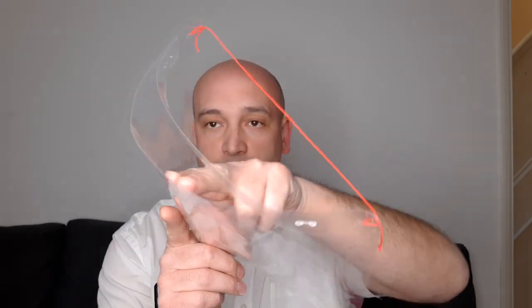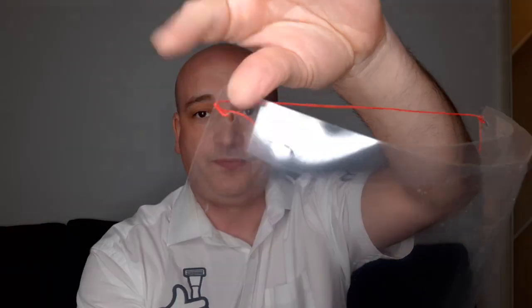This will then keep it held off your nose, and also because it's all plastic, it's very easy to clean, very easy to sterilise, and again it's going to cost pennies. Well, what, maybe 10p, 20p maybe for the entire face shield to make, and it consists of one full laminating sheet A4, part of a laminating sheet A4, a rubber band basically, and 2 staples with the hole punches. So very, very cheap to make. Put it on, you have the side clearance.